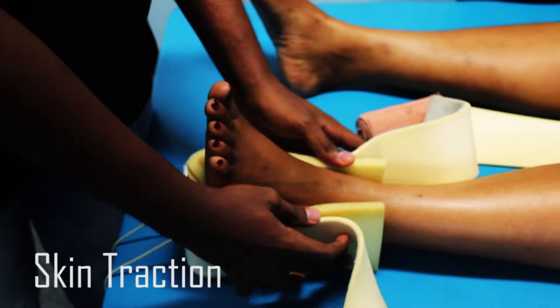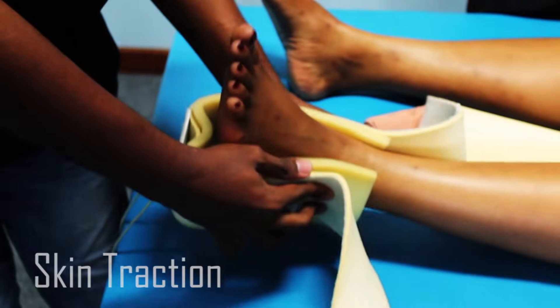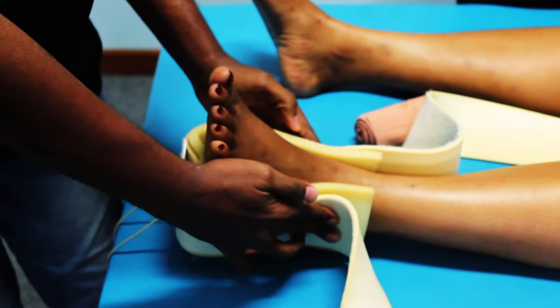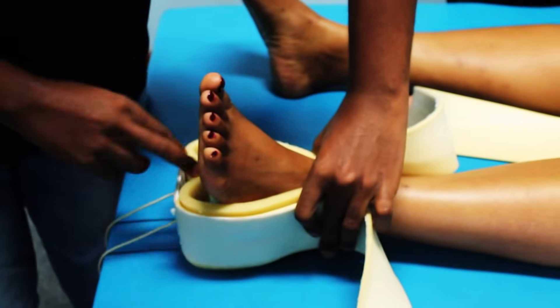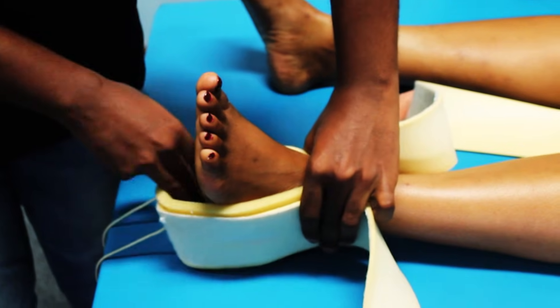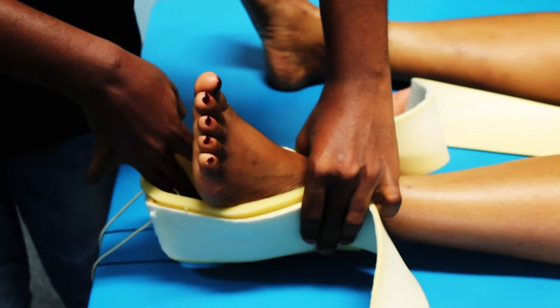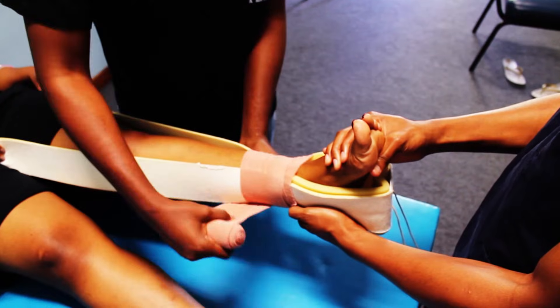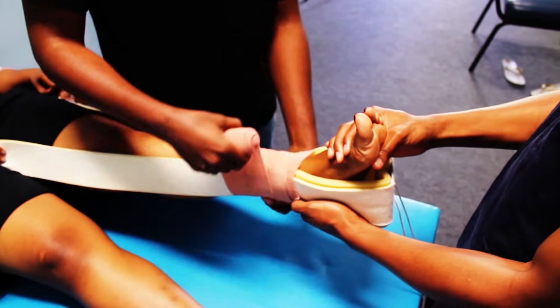With the help of an assistant, apply the skin traction device making sure that the double padded region covers the malleoli. Leave 10 centimeters below the heel to allow for adequate skin traction. Start by applying the bandage above the malleoli.